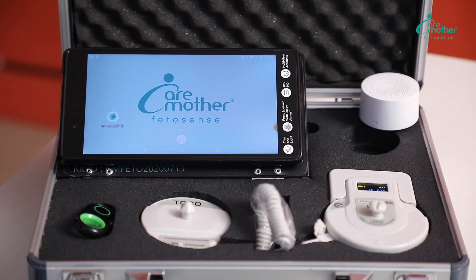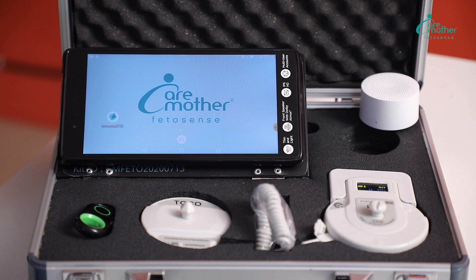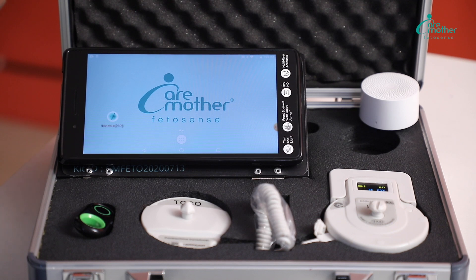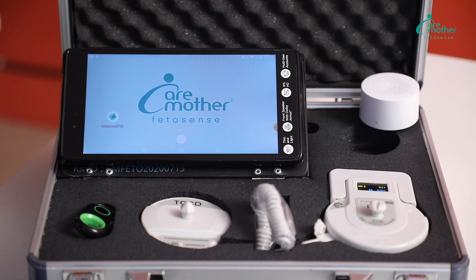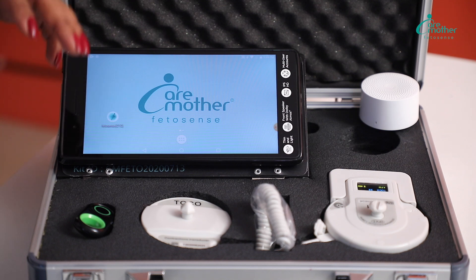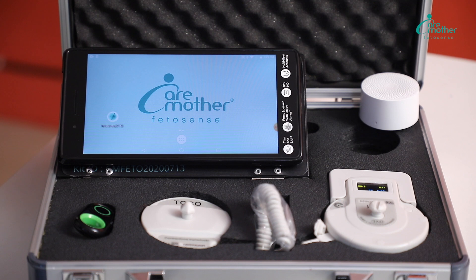As you see, Fetosense is a completely wireless and portable device. This enables you to move this device very easily around your facility from the OPD, IPD and labor room without the need of a cart. Secondly, this device can also be taken to the patient's home or at a field medical camp.